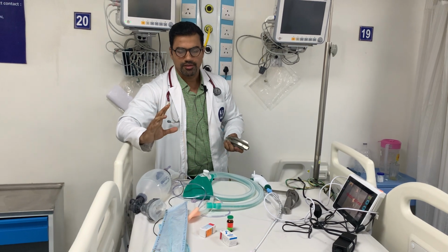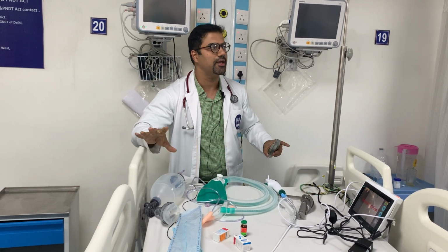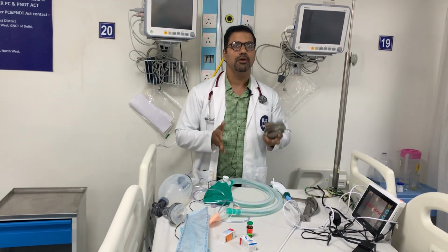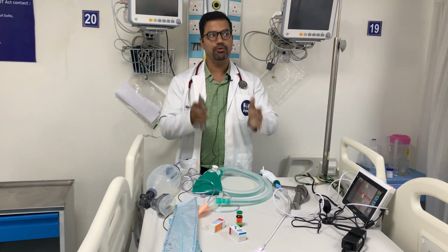There are a few things that you need to look at in the patient before intubating. I know the ICU or ER is a very hectic environment, but you have to have a quick look at the patient, whether your patient can be intubated easily or not. There is a mnemonic, LEMON. First, you have to look at the patient.